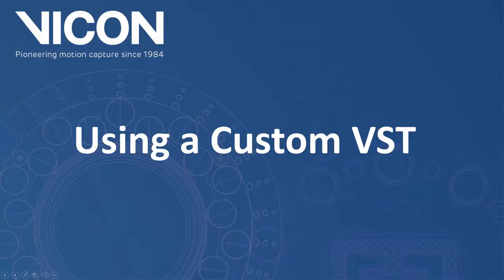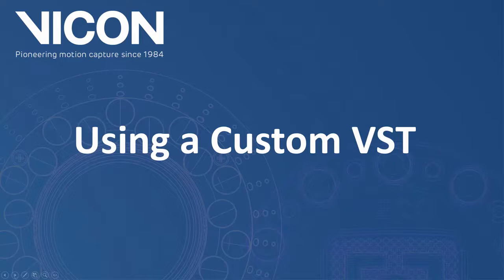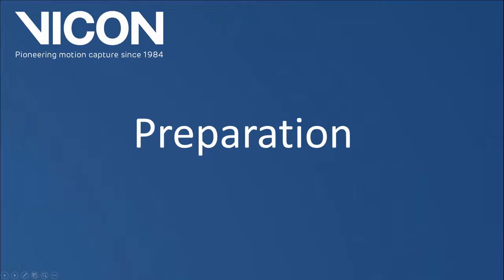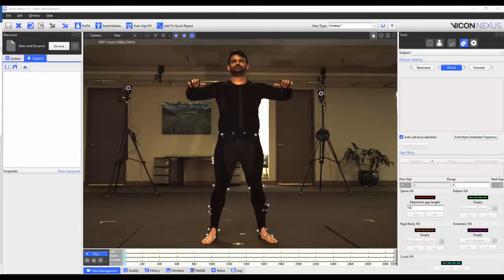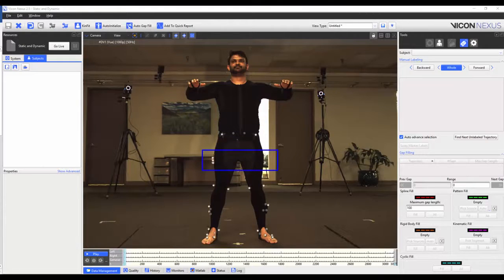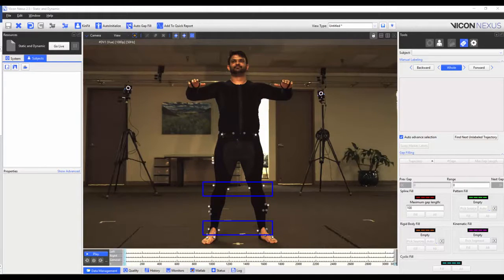Welcome to the Nexus 2 help guide. In this video we will be using a custom VST that we made in a previous video so that we can use the auto label feature. We have placed the same marker set as the previous video onto our new subject. These are marker clusters on the pelvis, thighs, tibias and feet. We've also placed calibration only markers onto the knee and ankle joints.